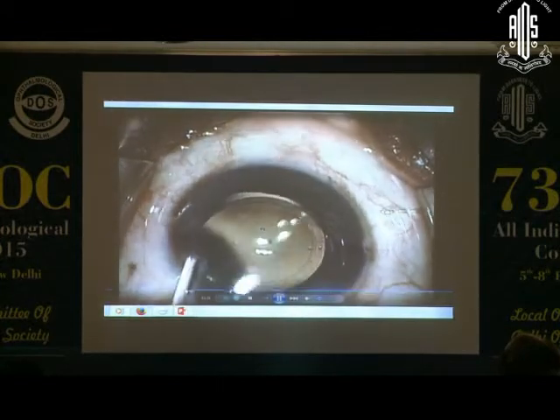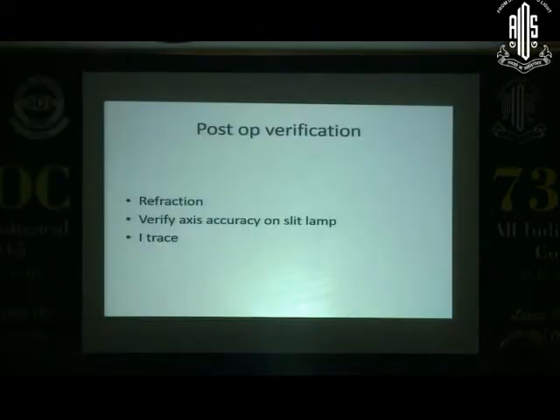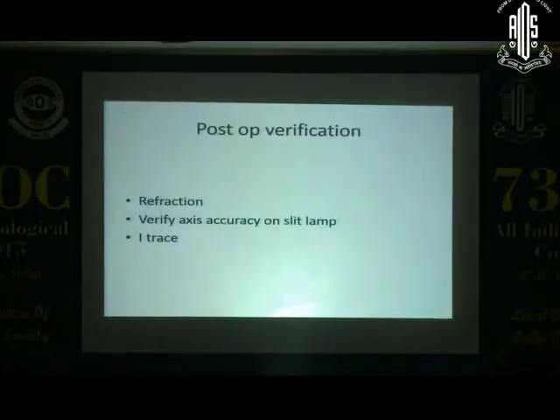So just a few slides on verification of this. So how do you verify? You can verify by refraction, immediate post-op. The moment you finish surgery, you can have a policy of taking the patient on the slit lamp, and with the pupil still being dilated, look for the axis of placement of the lens by placing the axis in line with the marking and read off from the slit lamp what the axis is.